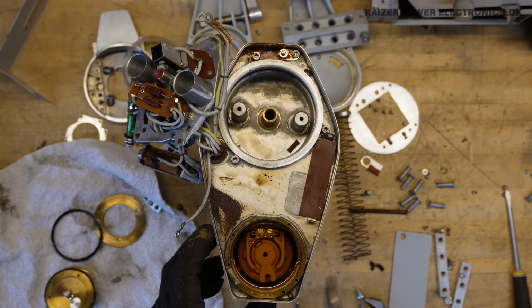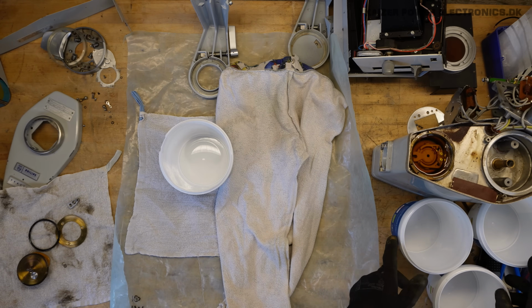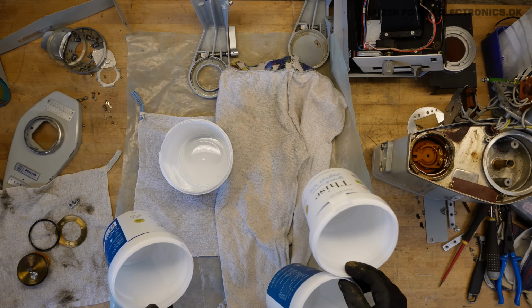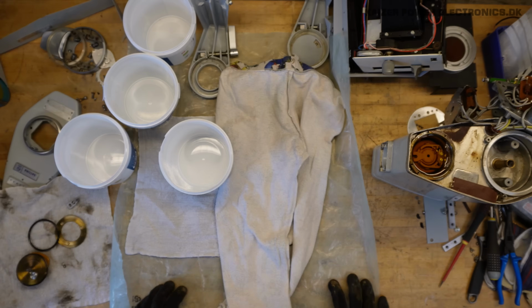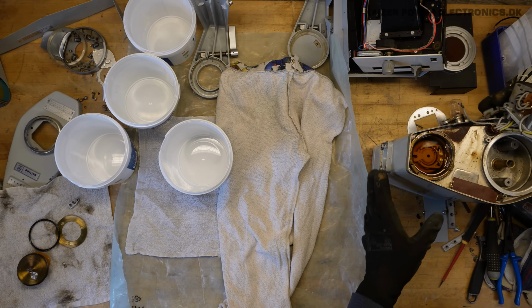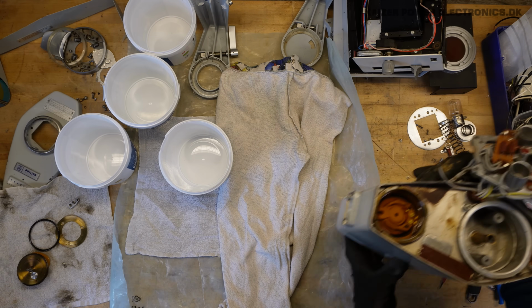So the next thing to do now is get rid of the oil. Well, I have been surprised before how much oil is actually inside an X-ray head, so I'm guessing 4 liters this time. We should see. Some plastic out on the work table, some cloth to absorb any spilled oil. So let's see how this goes.